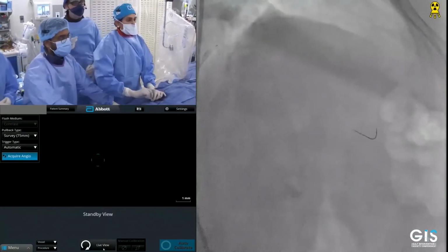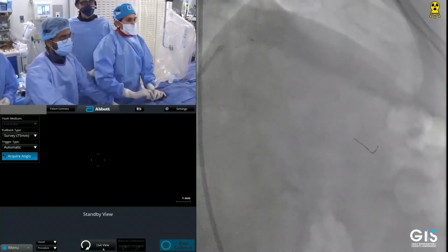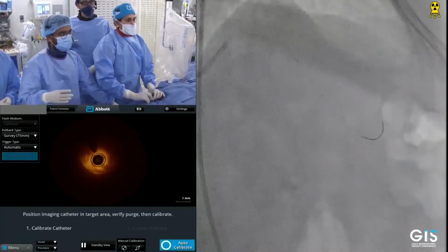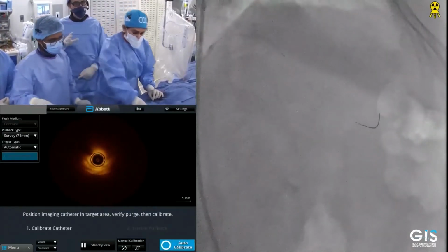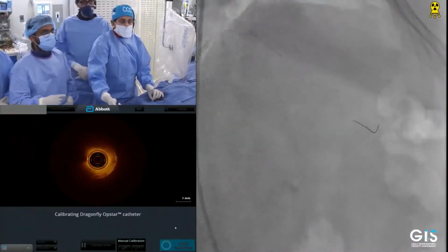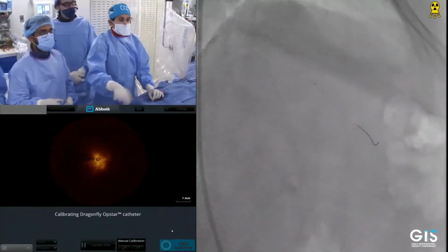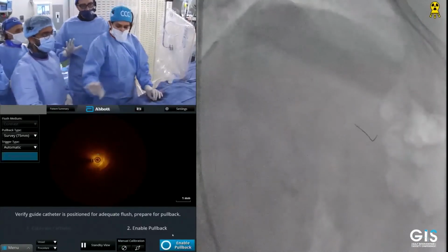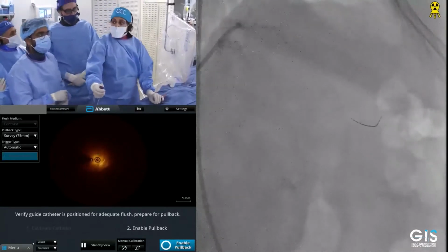This is a hand injection with about 7 cc's. By no means do an end-hole catheter with a forceful injection by the machine. Absolutely not, we never do that. This is just to give a general idea, not by the injector. Very good point.